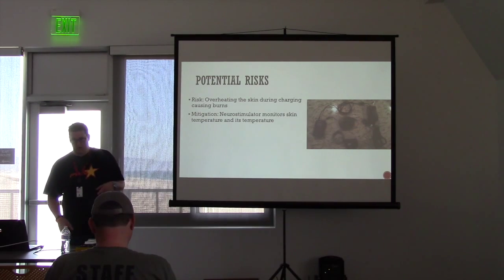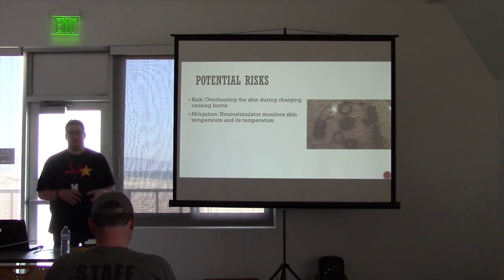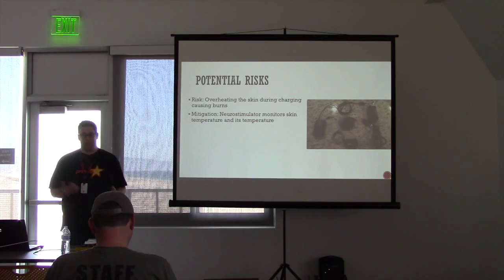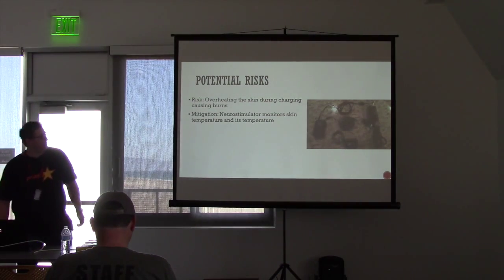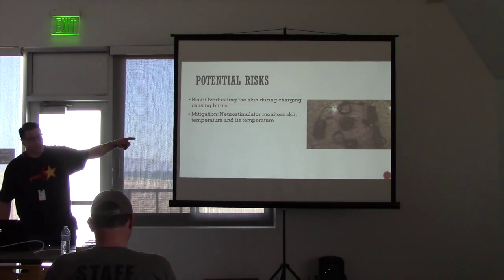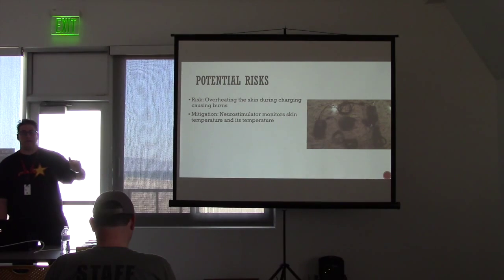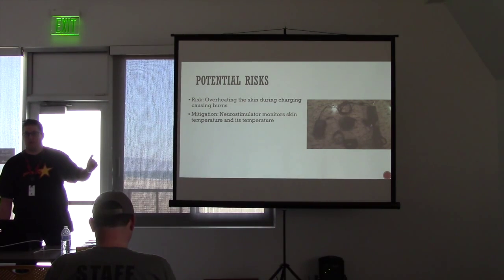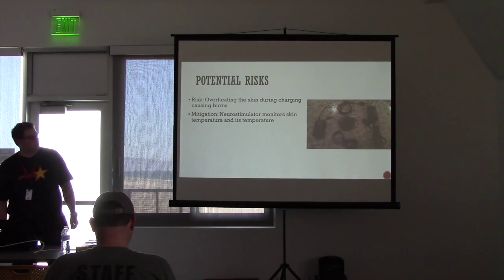This particular model that we found actually had a lot of protection for that, and that was one of the critical factors in deciding with the doctor which one we wanted, which he had never had that conversation before with a patient. In this particular case, it constantly monitors the temperature and will shut it off, and that monitoring comes from the device itself, not from the charging unit. So at any point, it stops listening if it is overheated.